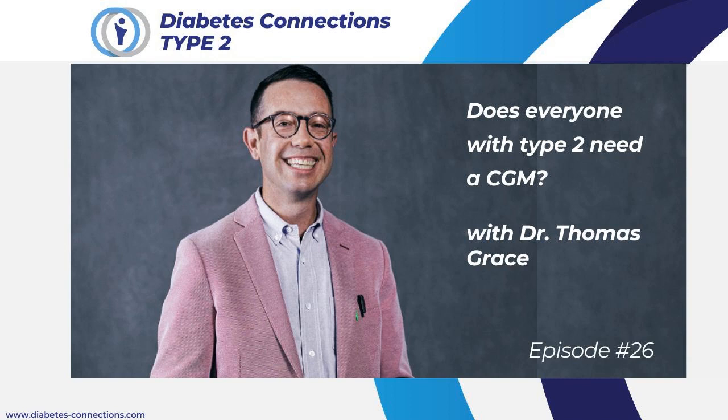This may change in the future, but right now, most endocrinologists will tell you that both together, the A1C and the GMI, are really what you want. It gives them a great picture. It gives you something that you don't have to wait 3 months for. And if you're not sure where to find it in your CGM data, every manufacturer, and there are 4 CGMs right now in the United States, I mentioned Libre and Dexcom, there is the Eversense and Medtronic, all 4 of them have a way in their apps to find this value.